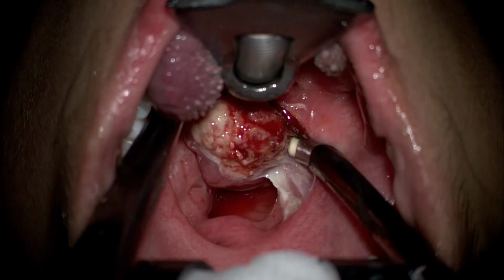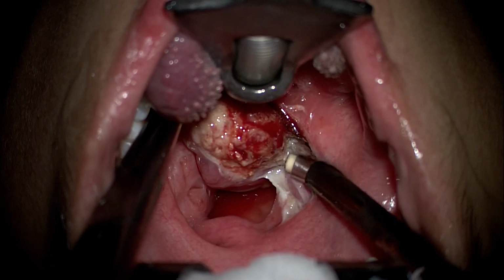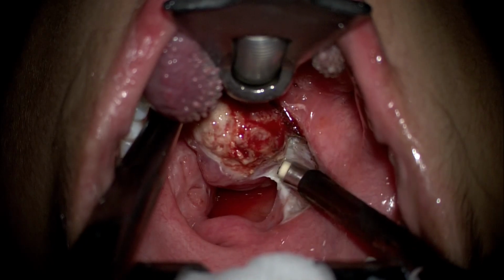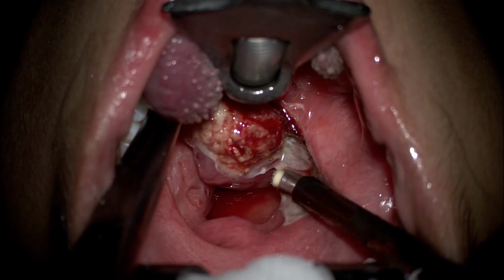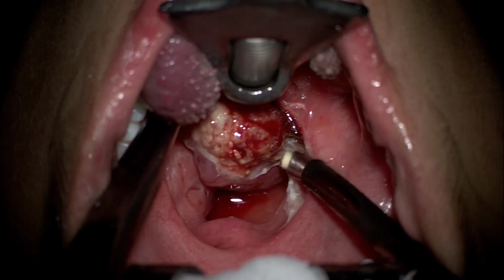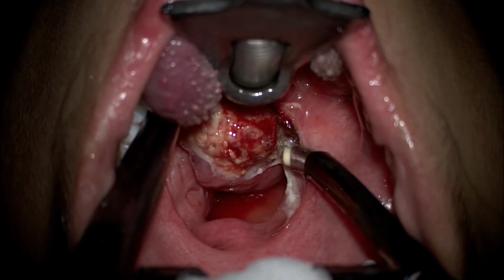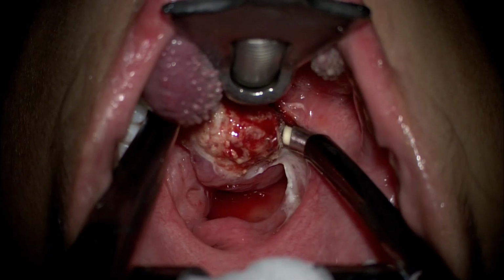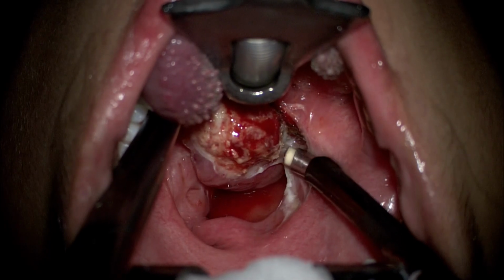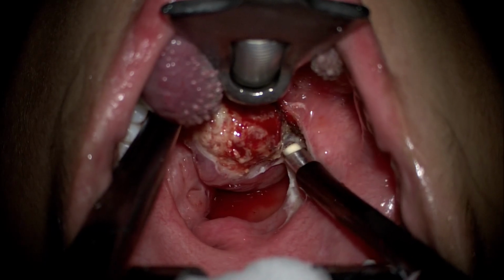Post this, we will use the coblation wand in gentle brushing strokes, again making the coblation wand face medially towards the tonsillar surface and not the tonsillar bed. As one can see, the slightest amount of muscular exposure is visible, but we can always try to keep that in check and highly limited, to help, again as I said, in healing as well as reducing post-operative pain.